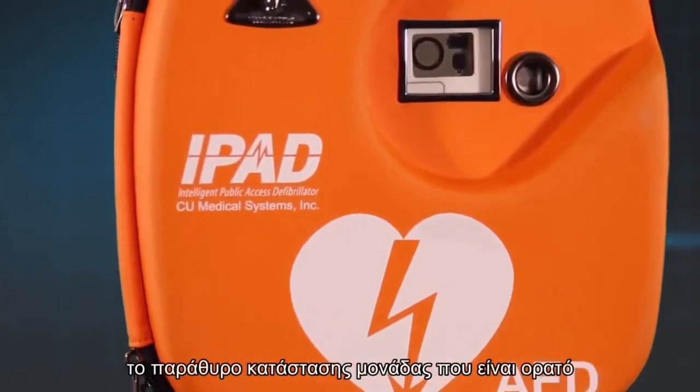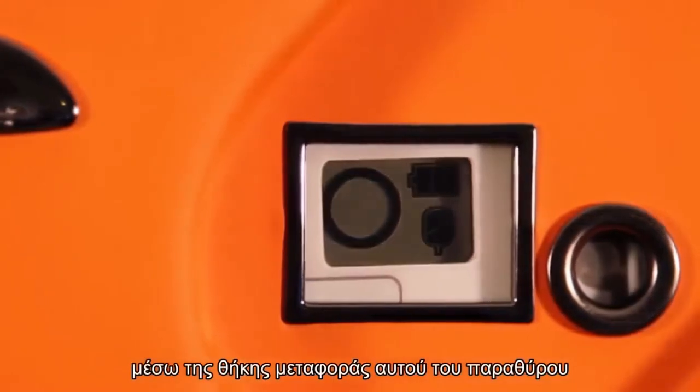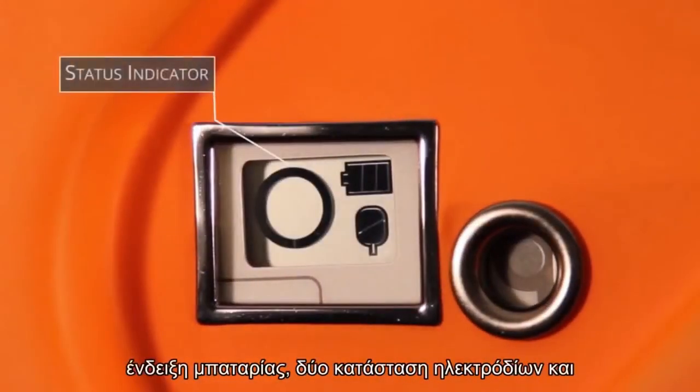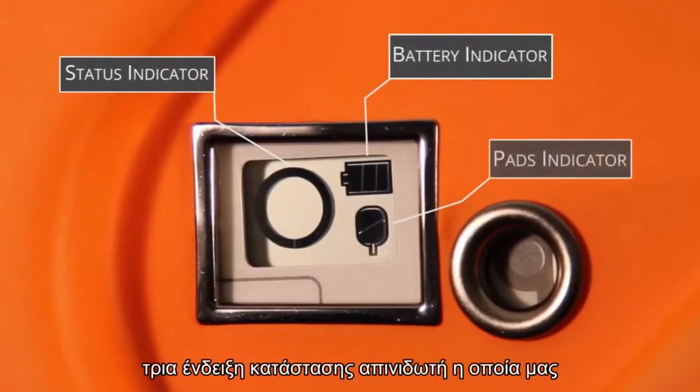This is done simply by looking at the unit status window, which is visible through the carrying case. This window shows three key things: one, a status indicator; two, a battery indicator; three, a pads indicator.